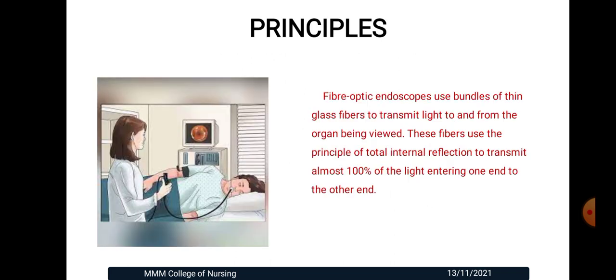Principles: fiber optic endoscopes use bundles of thin glass fibers to transmit light to and from the organ being viewed. These fibers use the principle of total internal reflection to transmit almost 100% of the light entering one end to the other end.